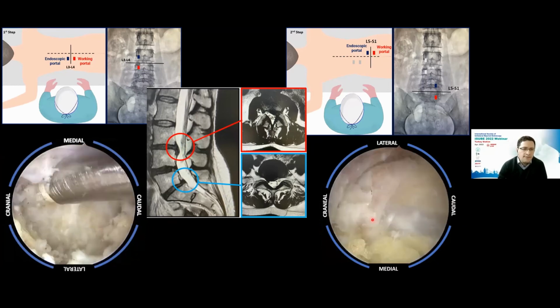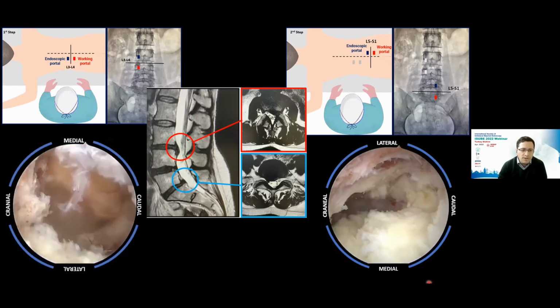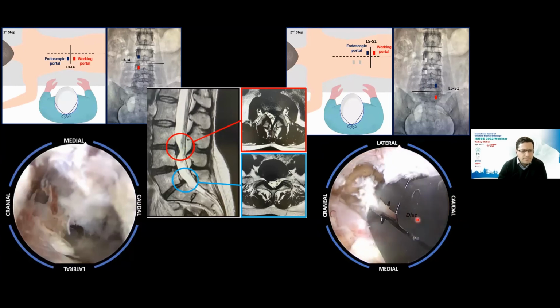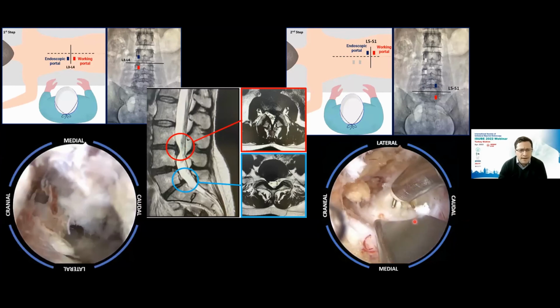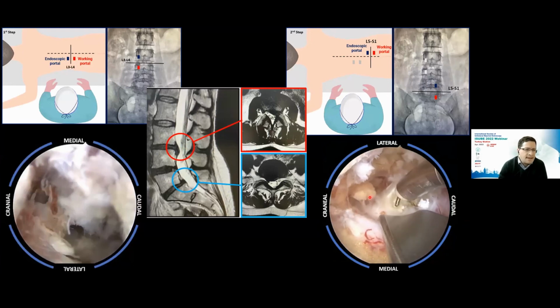Drill the inferior part of the L5 lamina, trying to remove in block all the flavum ligament, and when we retract the S1 root, we can now see the lumbar disc herniation and the fragment that is in the canal. So UBE gives us a lot of results and tools to remove a more complex case of lumbar disc herniation.